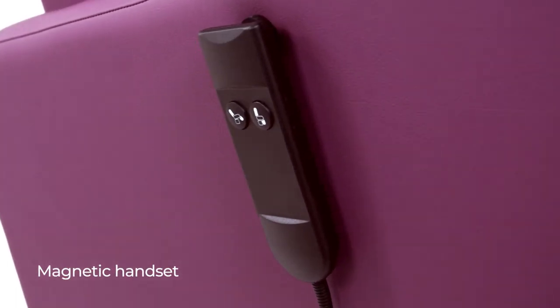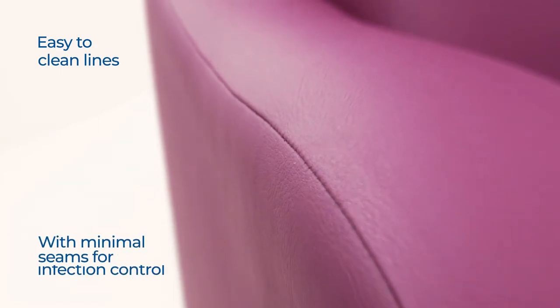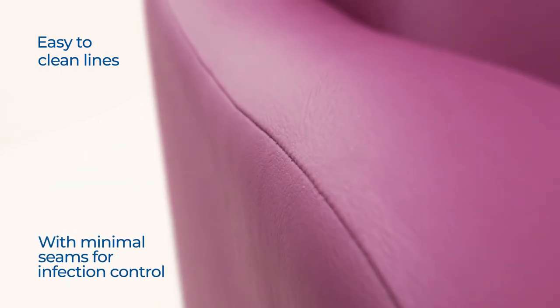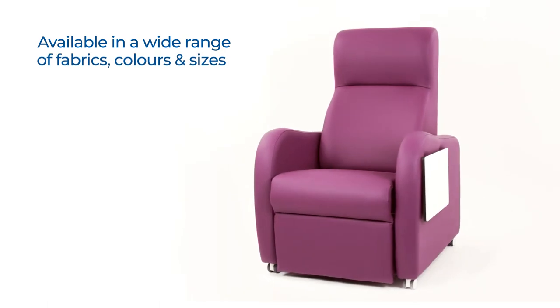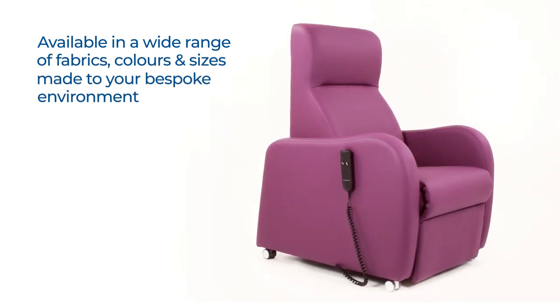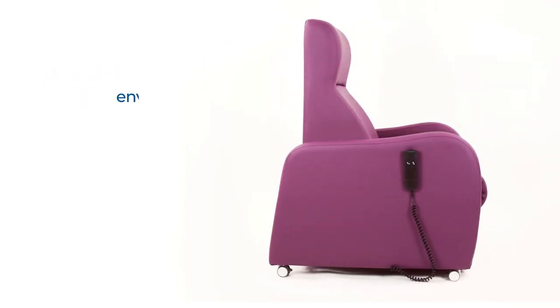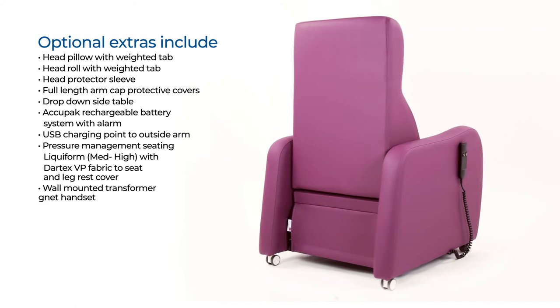Also available as an optional extra is a magnet handset. The Stamford is available in several materials, including the Virus Fighting Cadet Shield Plus, Valencia and Dartex VP, with other bespoke fabrics available upon request.